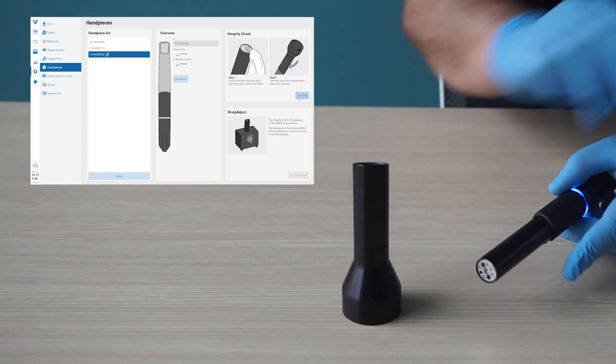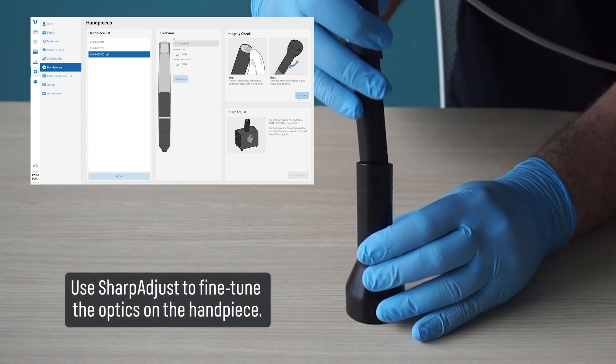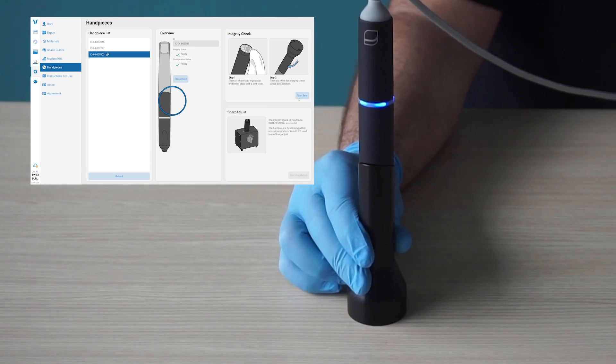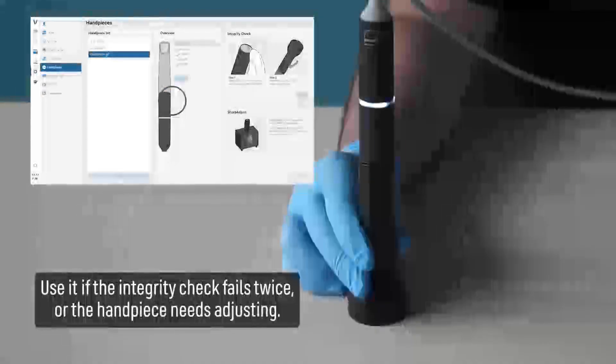Use Sharp Adjust to fine-tune the optics on the handpiece. Use it if the integrity check fails twice or the handpiece needs adjusting.